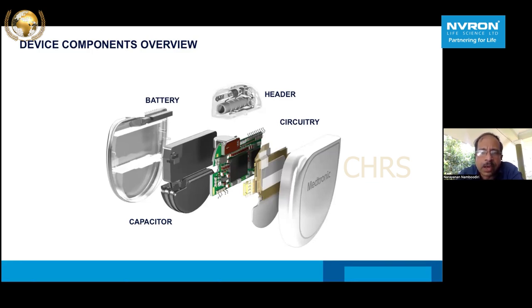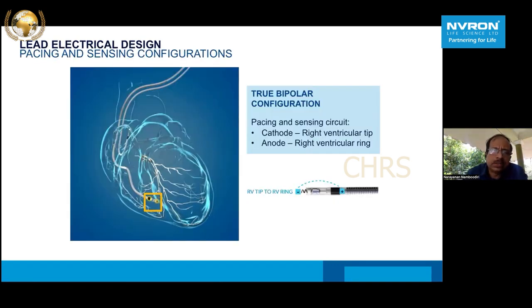And you need to have a capacitor, you have a battery, these are the components, and a complex circuitry as well. So how does it recognize the ventricular fibrillation or ventricular arrhythmia? It is called bipolar sensing. Why is it relevant? Many times people ask whether they can remove a tooth or apply a cautery far away from the pacemaker and all those things. Ideally, this bipolar sensing should sense electrograms only within this closed circuit.